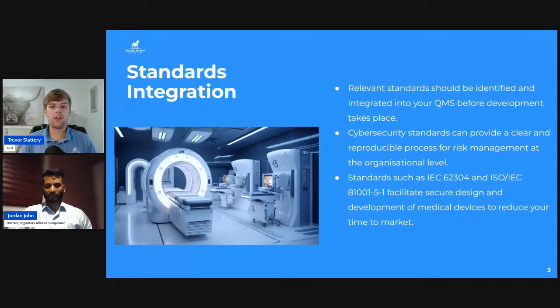How can we set up our QMS according to ISO 13485 and have all of our risk management procedures, any of our development SOPs, everything that we're going to need ahead of time put into place? Of course, this is going to branch outside of cybersecurity. This can handle anything from your safety risk management, your business risk management, how you're handling anything across your biocompatibility studies and your clinical validation. So this is something that should be considered across your entire medical device lifecycle.